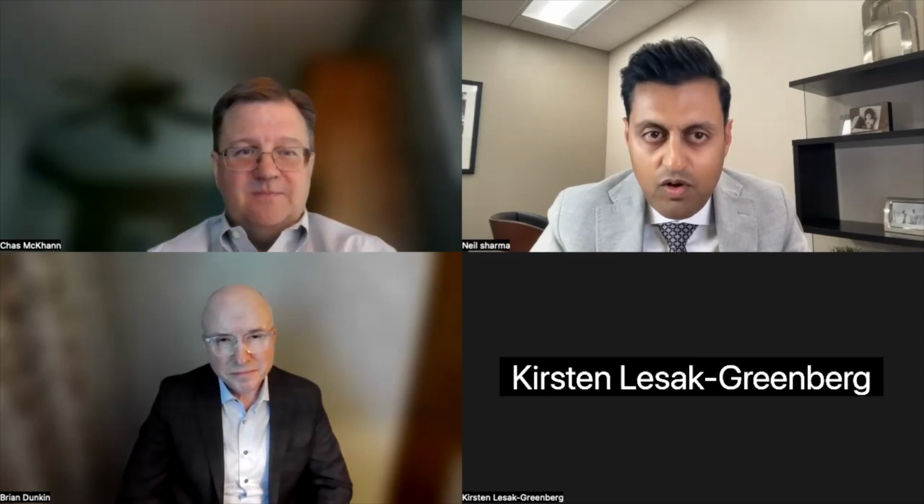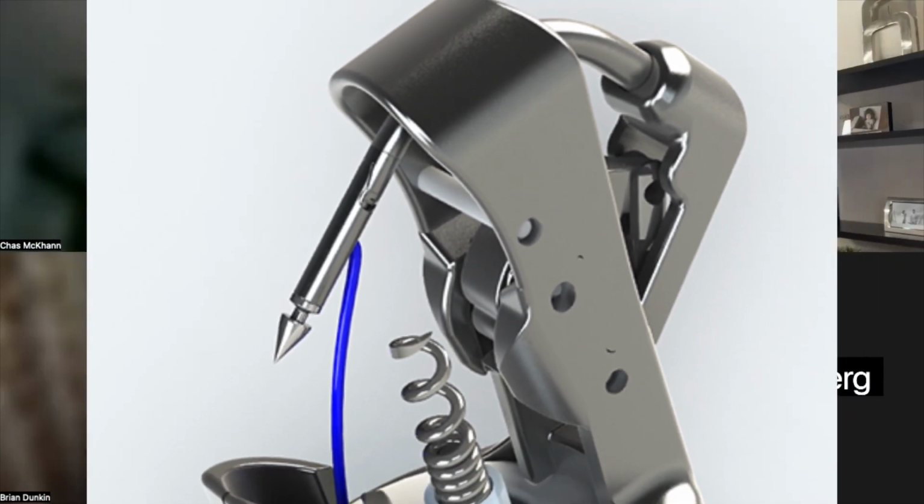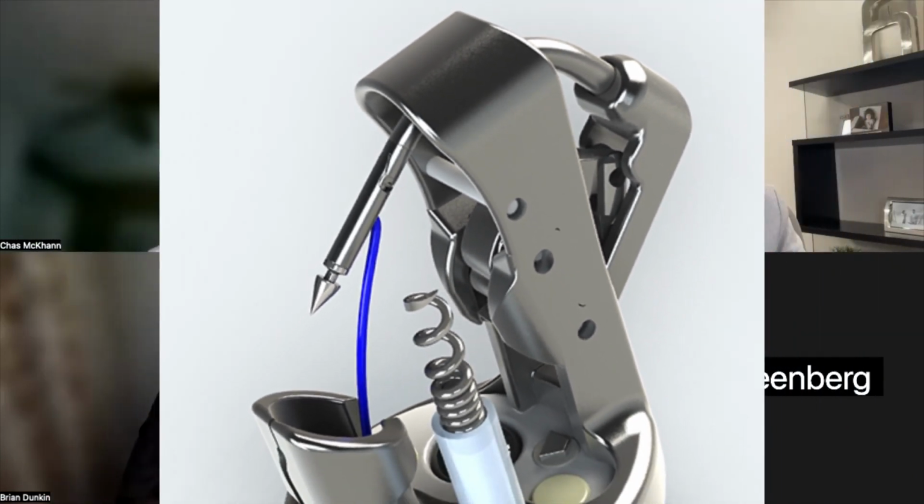And so talk a little bit about that early device. You went from 1.0 to 2.0. What were the things that you needed to change from an engineering or device development standpoint to make it what we're utilizing today, which I would say is a very useful device that goes over a double channel scope for those who have not utilized it.